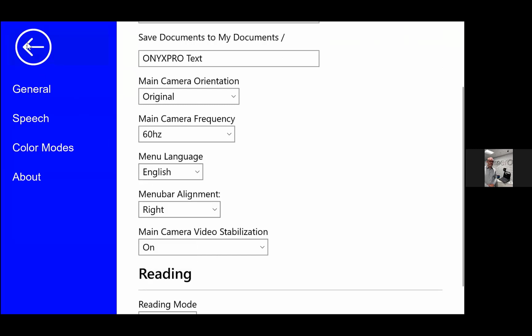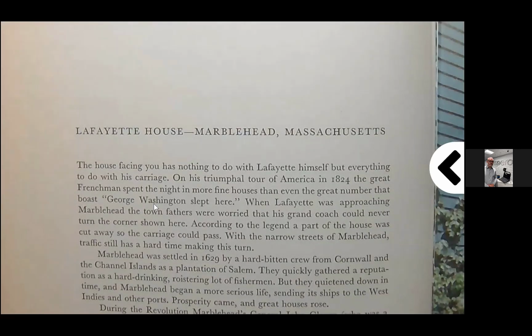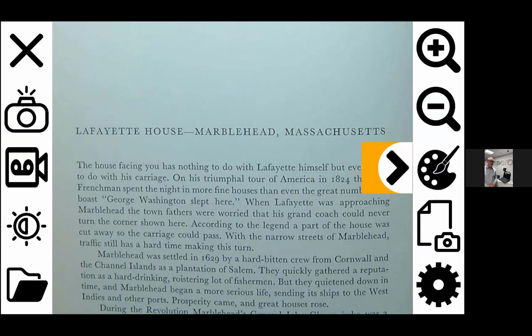Then I'm going to click on this large arrow here at the top left to get me out of the menu. Now you'll notice that arrow that I talked about earlier, that was at the top in the middle, is now in the middle on the right-hand side. When I click that, all of my menu options are on the left and the right-hand side. I like this because I think it's easier to access, especially from the touch screen. You're not reaching underneath the camera. And you've got your full central vision of the text.